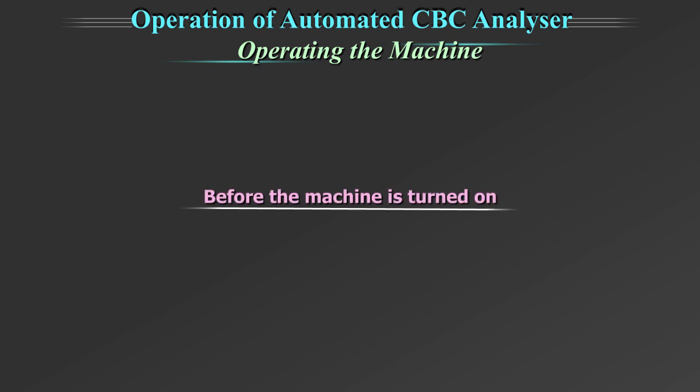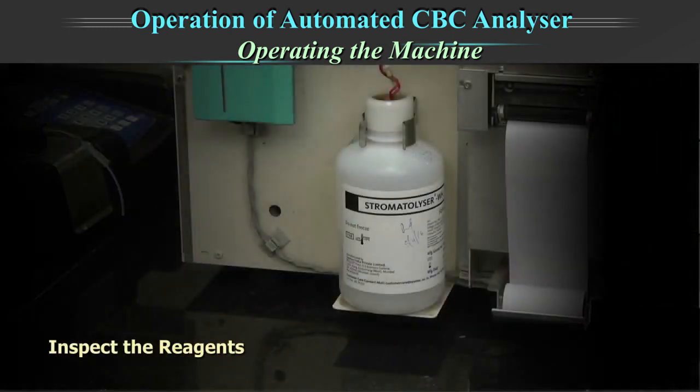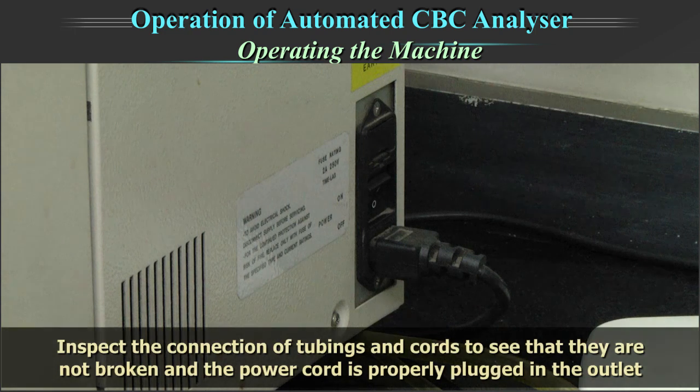Before the machine is turned on, inspect the reagents, and inspect the connection of tubings and cords to see that they are not broken and the power cord is properly plugged in the outlet.